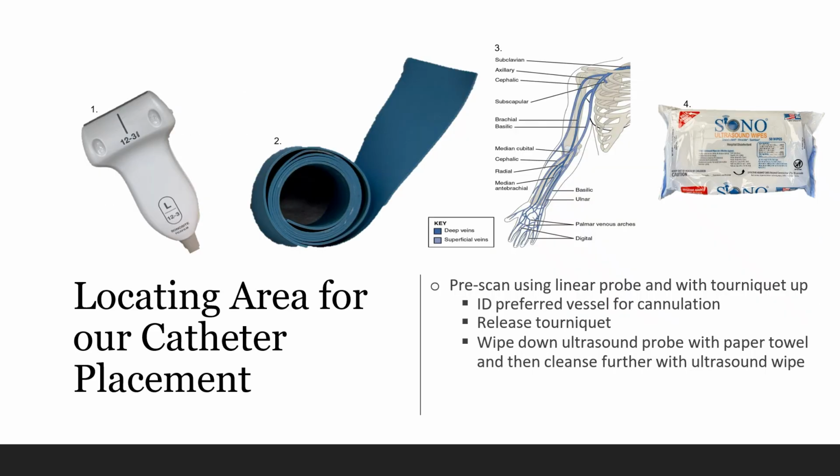Okay, so now that we either have or have not had to obtain that informed consent, depending on your actual protocols in your institution, we need to get the patient set up in position so they're nice and comfy, you're nice and comfy, you're not bending over your back, your arms are in comfortable spots, they're not going to fatigue, and the machine's in a good sight line, so you can start assessing the patient and determine which vein you need to stick. So the probe of choice for this would be your high frequency linear probe.